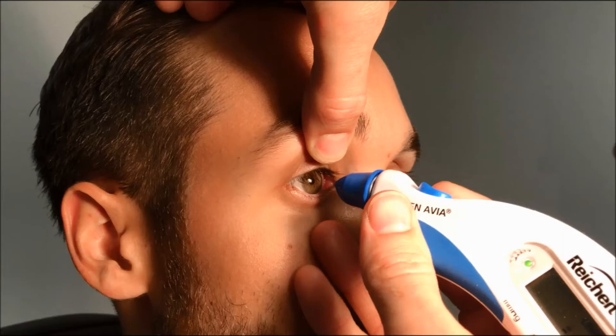To use the tonal pen, gently tap or applinate the tonal pen tip to the cornea, using care to tap perpendicularly. Coming from an oblique angle or sliding the tip across the cornea will cause inaccurate and inconsistent measures. You'll hear the tonal pen click or chirp about 10 times, and then it will display the IOP as well as the confidence interval.